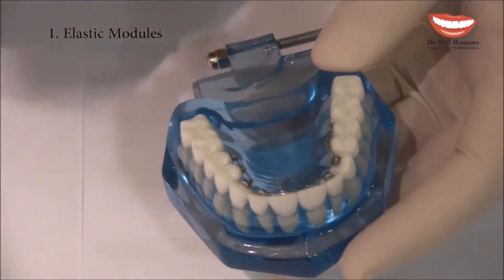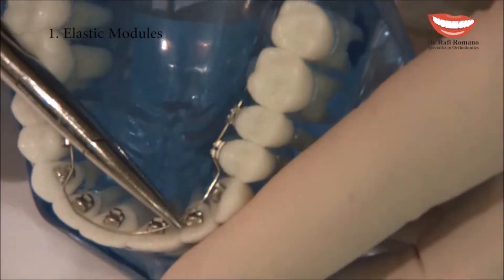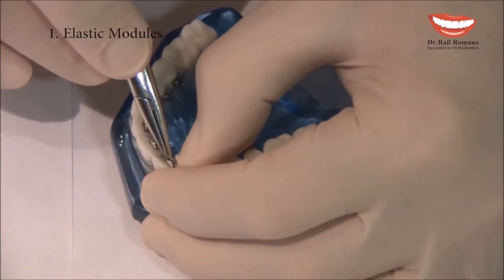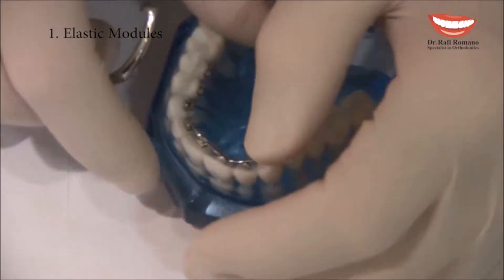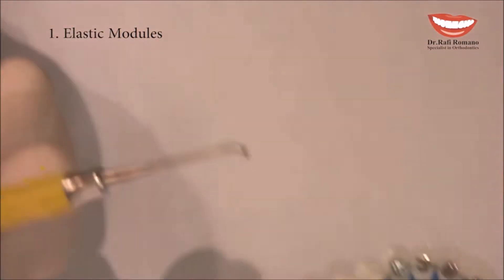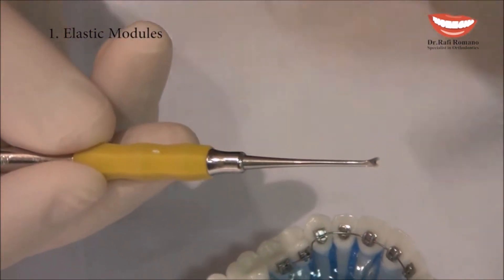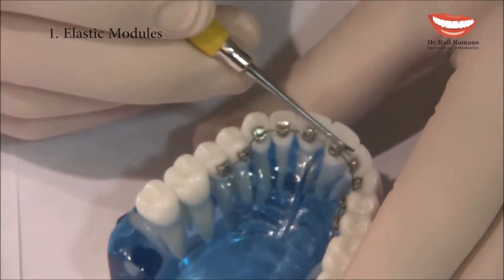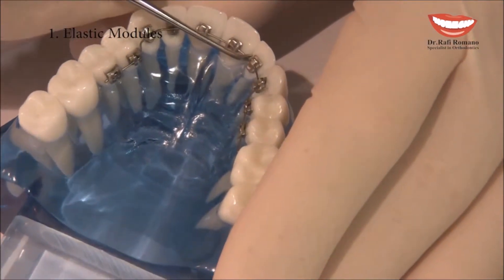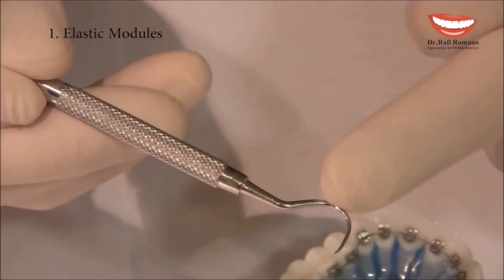Now I will take the wire a little distally to fit into the slots. Two other useful tools I use are the ligature director, which is angled at 45 degrees to fit for lingual use, and I guide the wire deep into the slot in the mouth.